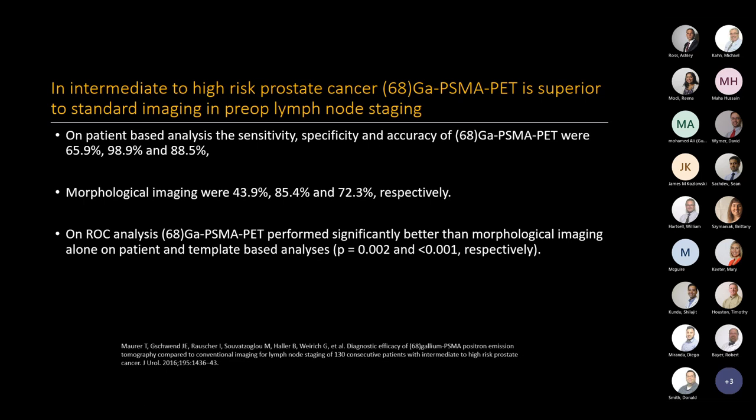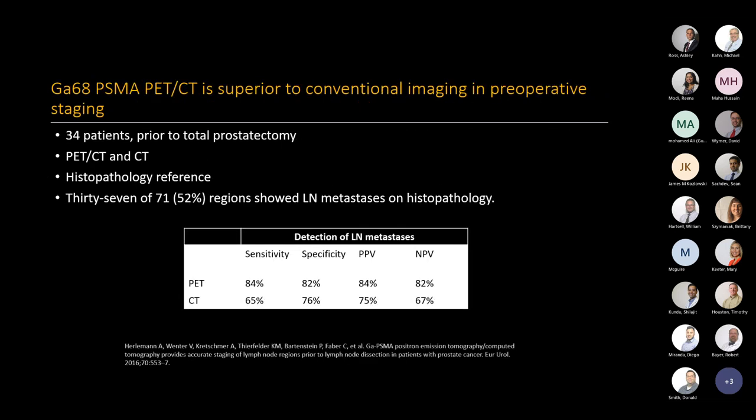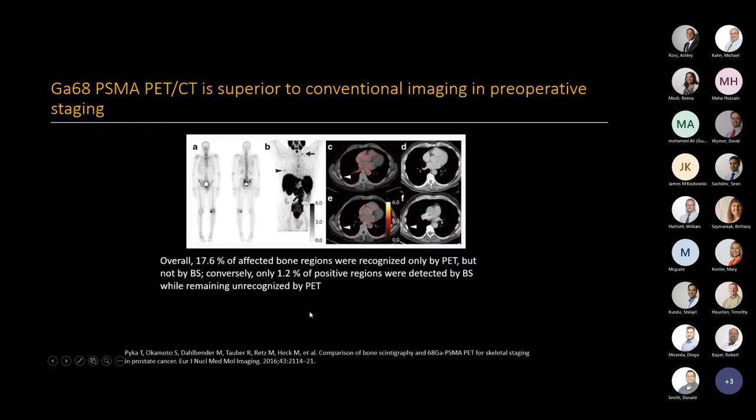There is a lot of research out there, and the accuracy was almost 90%. It is sensitive, but specificity is much higher than sensitivity. I have another slide I will show you, but we have to be very careful about the positivity and the location, so as not to overcall some other abnormalities, cancers, or benign abnormalities that might have PSMA expression. It is superior to conventional imaging in staging. Sensitivity and specificity are higher than CT imaging. And also it is superior to bone scan or other types of bone imaging in preoperative staging.